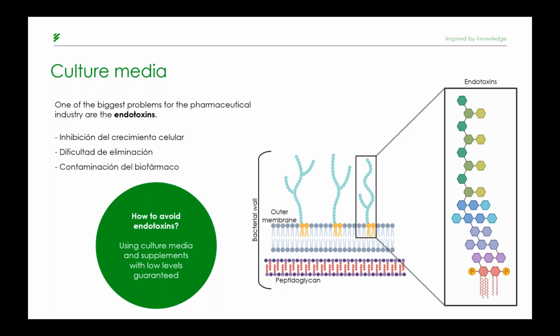This is due to their ability to inhibit the cell growth, reducing the yield obtained in the bioprocesses.